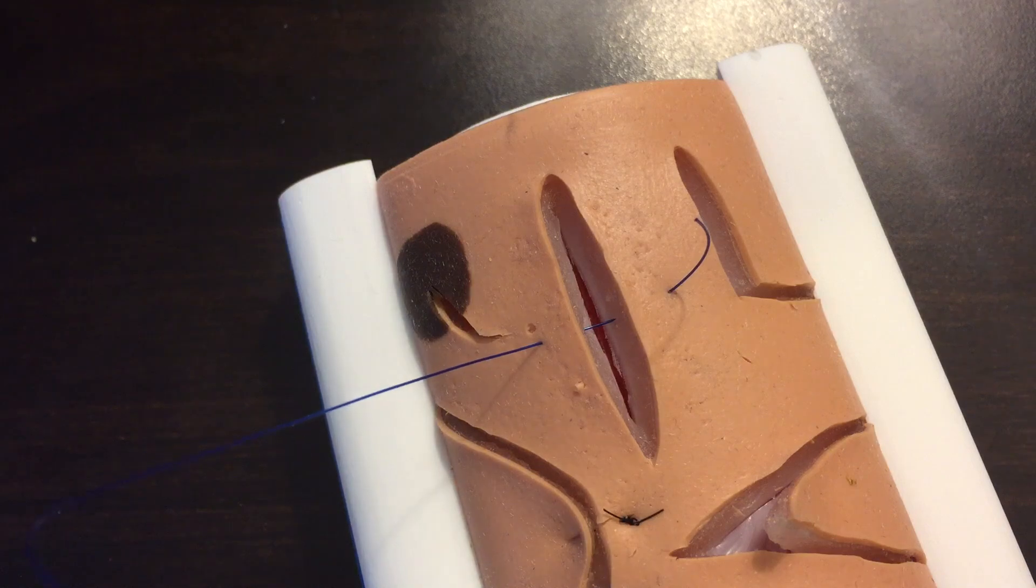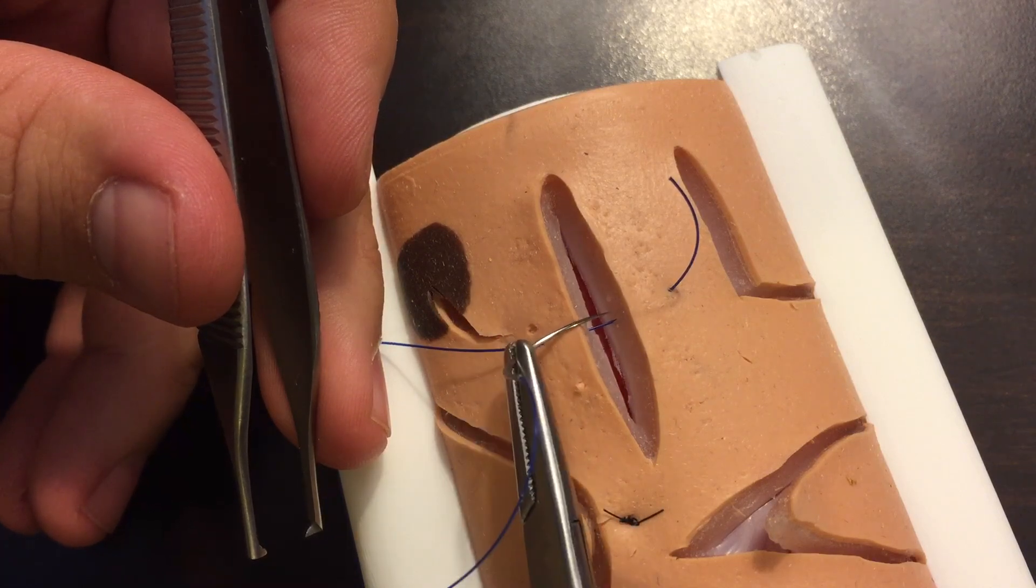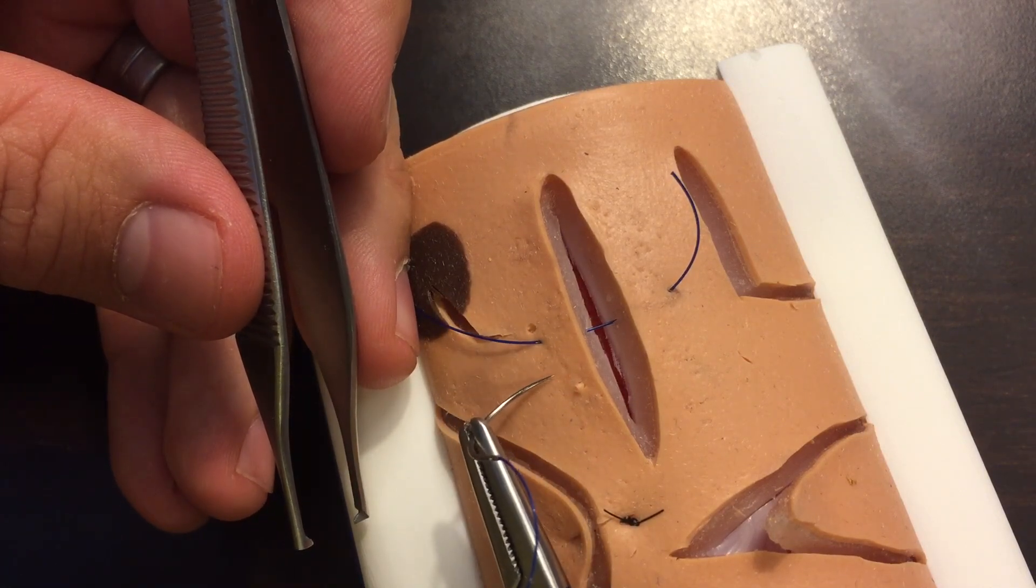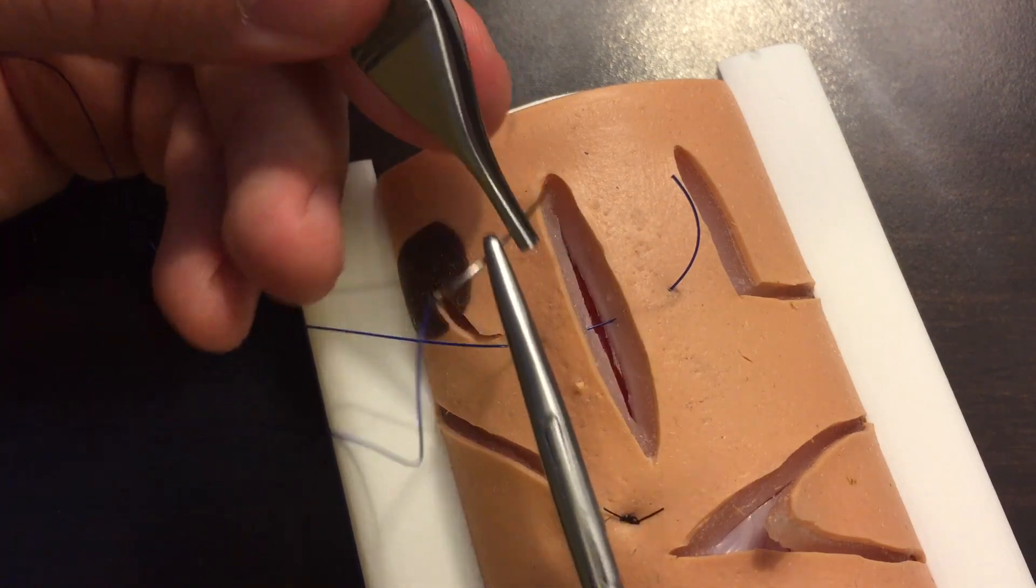Now with a vertical mattress suture, you're going to be entering at that same plane just much more superficial and much closer to the skin edge. But with a horizontal mattress, the difference is we're going to be coming back the other direction. You're going to load your needle backhanded like this.